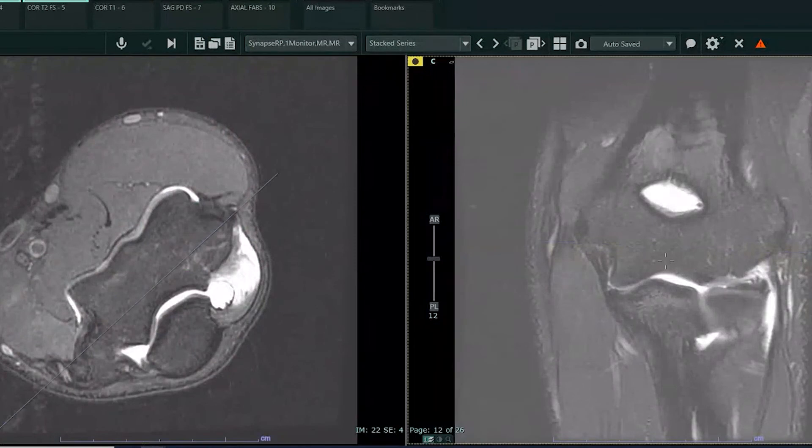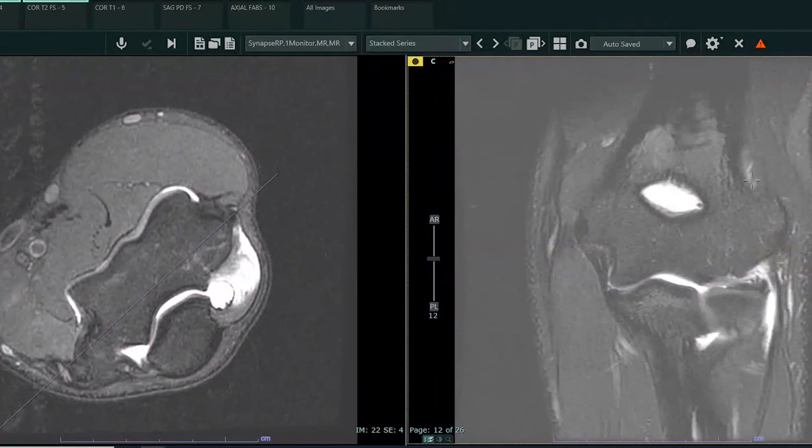So this is a normal MRI of the elbow, specifically this is an MRI arthrogram. An arthrogram is where we inject contrast into the joint, in this case the elbow, and then the patient gets an MRI after. The reason we do the arthrogram part is it enables us to better see some of the smaller structures around the elbow, specifically ligaments.